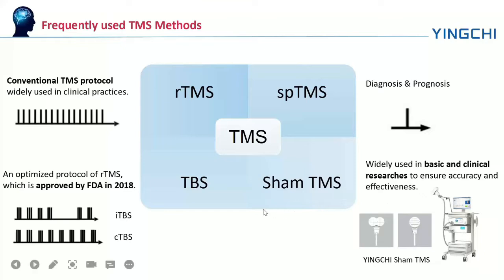And for clinical use, rTMS is widely used, and it is also a conventional TMS protocol widely used in clinical practice. And there is an optimized pattern of rTMS, which is the CTBS and ITBS, and it was approved by the FDA in 2018.